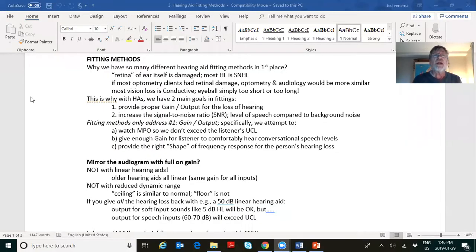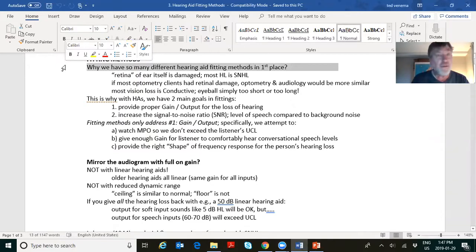So with that in mind, now we share screen and look at our notes together. Here's how it begins. So this is a review from 150. We covered ANSI testing in unit last week. You looked at non-electronic acoustic modifications the week before, and you're looking at fitting methods today and next week at least. For the next couple of weeks, we're looking at fitting methods because I want to make sure that we are grounded well in our fitting methods.